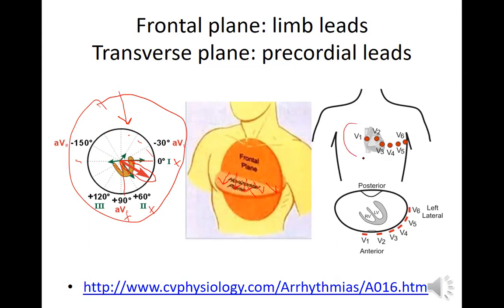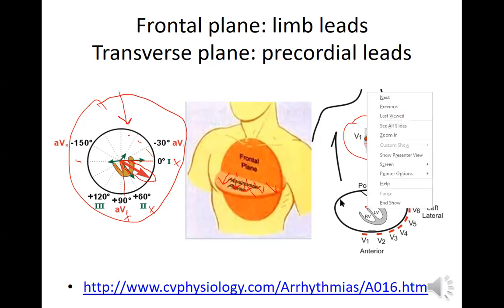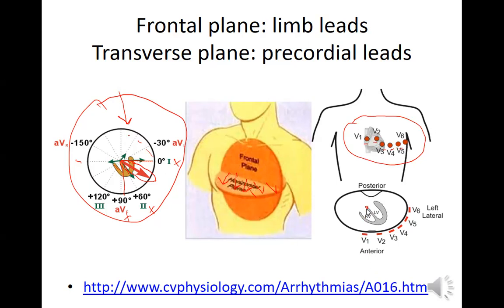This is kind of good here because you could see the heart. You can see great vessels. You can see where everything is. And later on, you'll see a picture which actually has the intercostal spaces. So again, remember these leads. You could draw this, always practice, put the SA node right there, because that's the junction. And all the time in this lab, we're talking about ventricular axis, ventricular rotation, really.